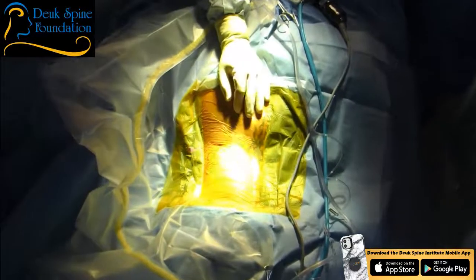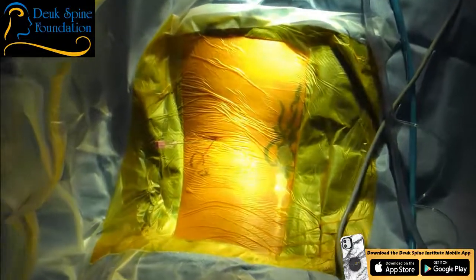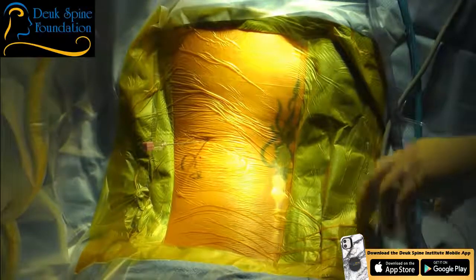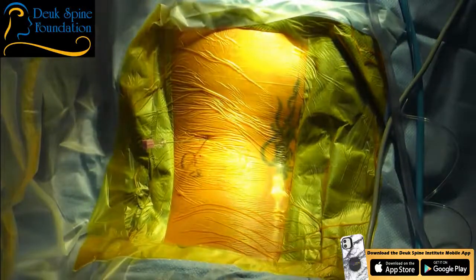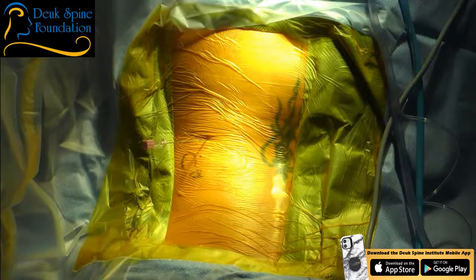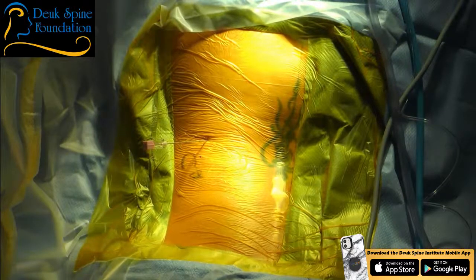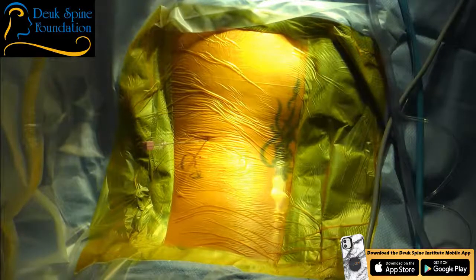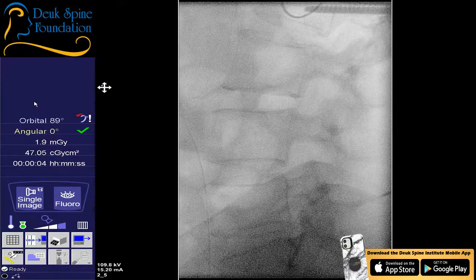So you can't drop the fluoro, right? That's good. Okay, shot. Let's get that end plate of L5 lined up with S1. How long have you had back pain for? Do we know? Since she was 28. All right, so how many years? I don't know what to make of that, Jordan. 12 years. No, 14 years. 14 years of back pain.